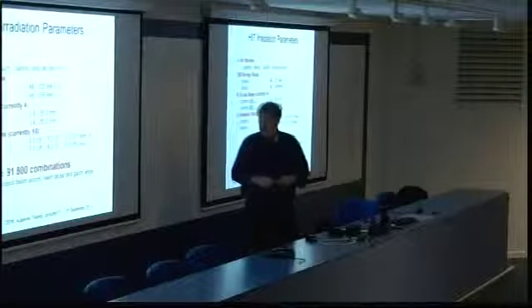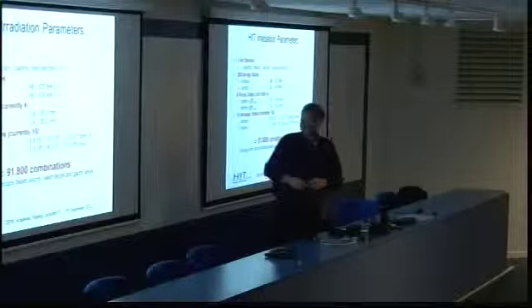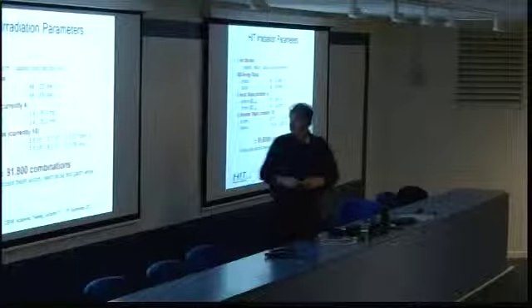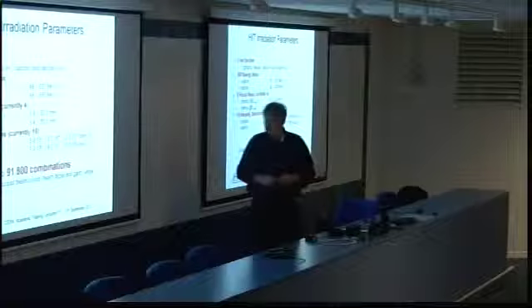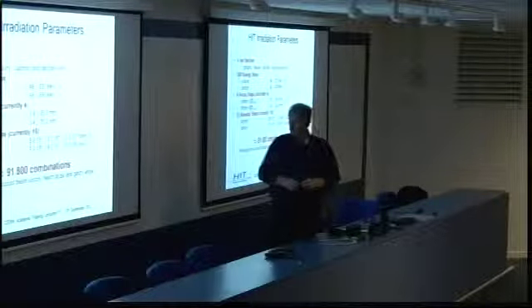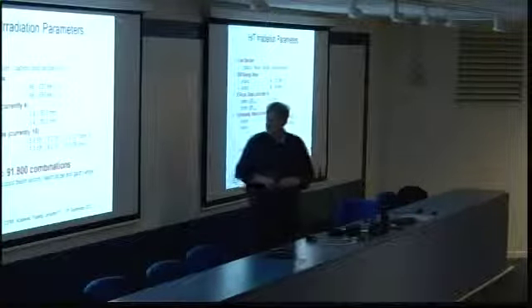And we want to have at the end 15 intensity steps. At the moment, it's only 10. For protons, it is in the order of 10^7 to 10^10 ions per second, and a factor of 10, 15, 20 lower for carbon. This is what the machine has to do altogether, without taking the beam target and gantry angle into account.